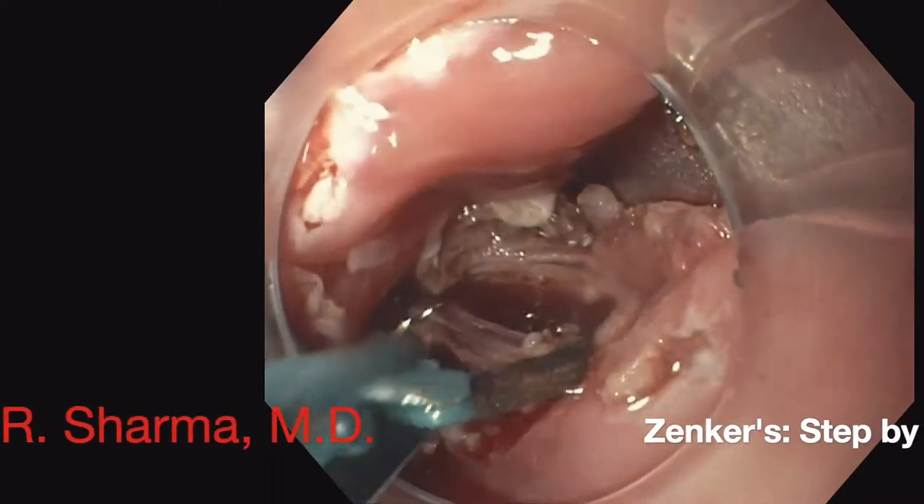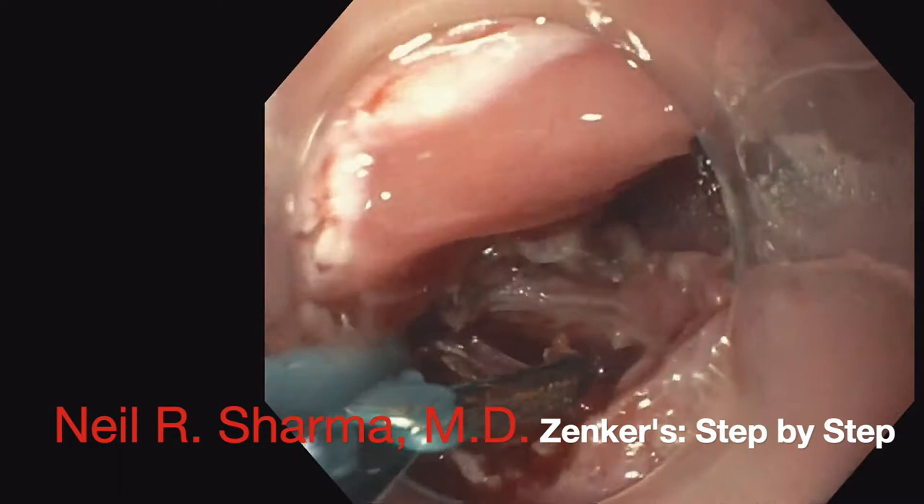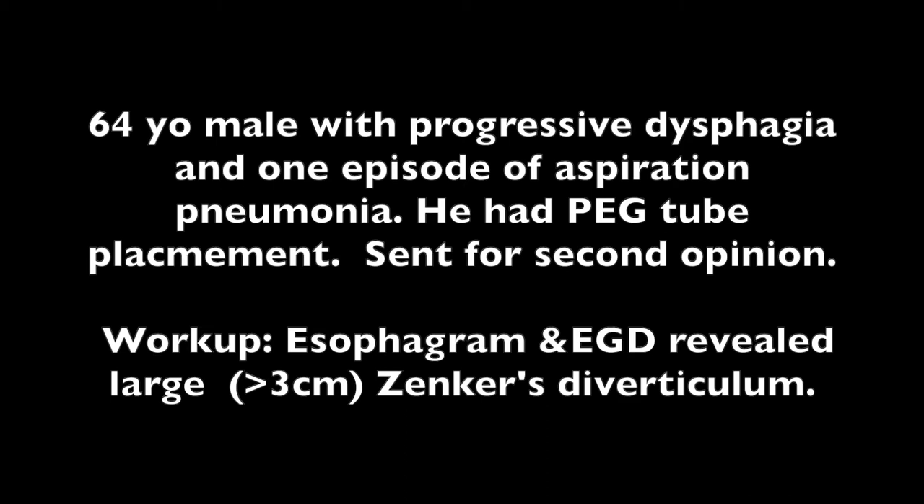In this video, I take you through a Zenker's diverticulum repair step-by-step, giving you key tips and tricks. We'll use a clinical case-based scenario to highlight Zenker's diverticulum repair.